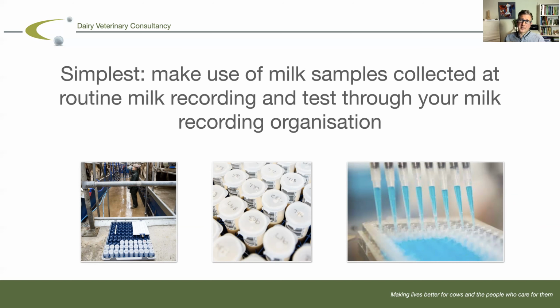However, concentrating on the milk test and how it can be used in dairy herds, it does make sense to make use of milk samples which are collected at routine milk recording and have these tested through your milk recording organization. This is certainly true for all farms that are having regular herd milk recording. That's the most logical thing to do.